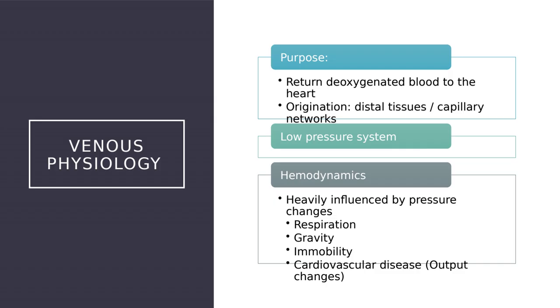But if you are the arterial system, if you're the aorta, we're not going to see a lot of pressure changes because it's constantly under a high pressure state. So we're not going to see this kind of lackadaisical change in diameter. We are going to see very rhythmic pulsatility and continuous diameter changes because it's always going through the same amount of pressure with each cardiac contraction.